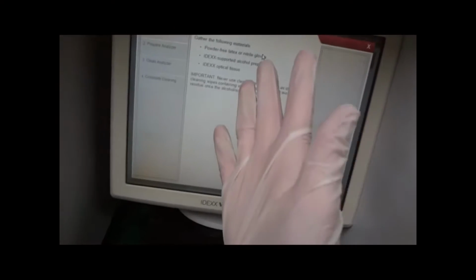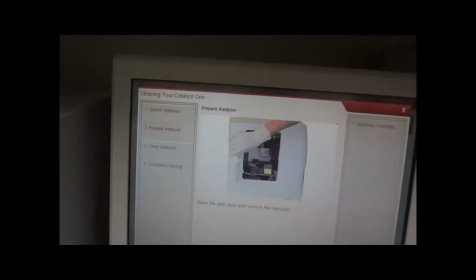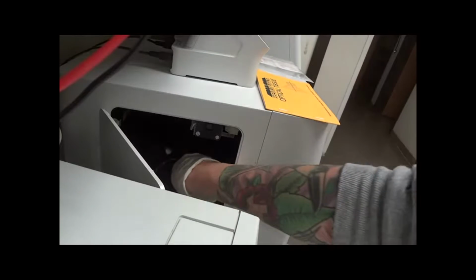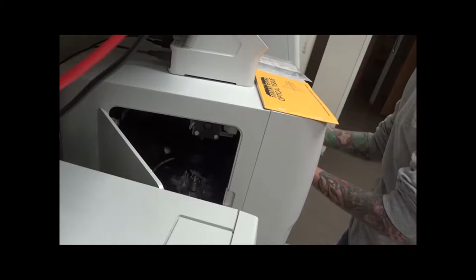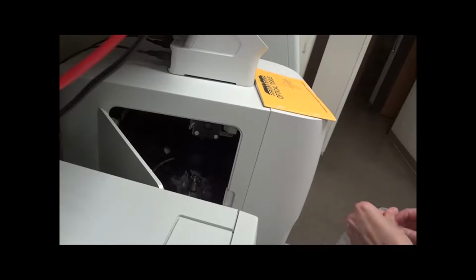So I've got my gloves, my alcohol prep pad, and my optical tissue. From here it kind of tells us step by step, and when we've completed each step we select next. So first we'll need to open the door here, pull up on this, remove the incubator ring, take our alcohol prep pad, and it instructs over here what to wipe down.